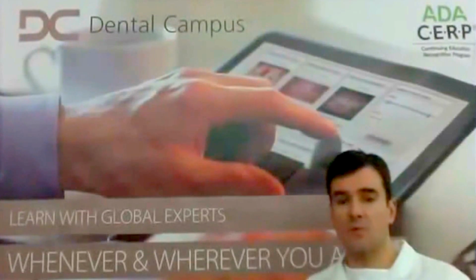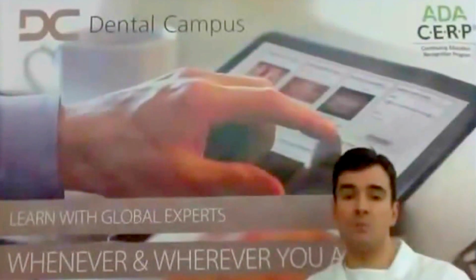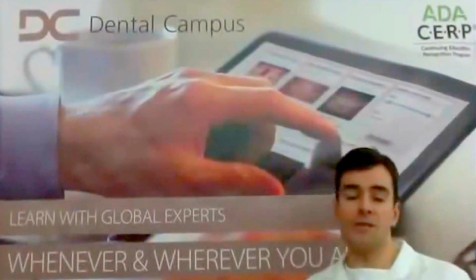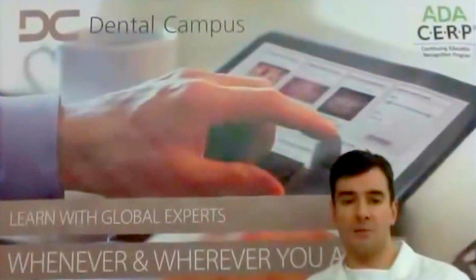So again, to wrap it up, in the posterior, if you want to simplify the bone augmentation, bone management technique, then you go for this. In the anterior region, you do it to keep the volume in the aesthetically demanding cases.